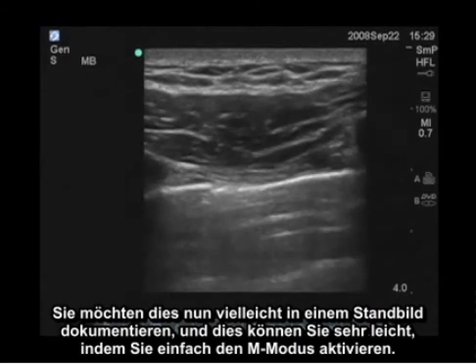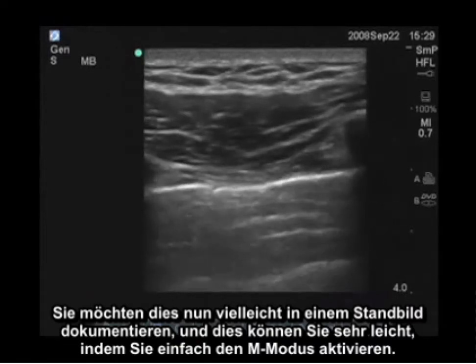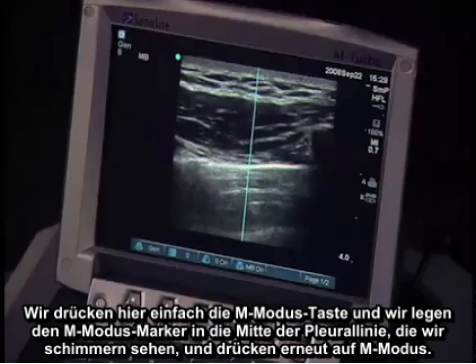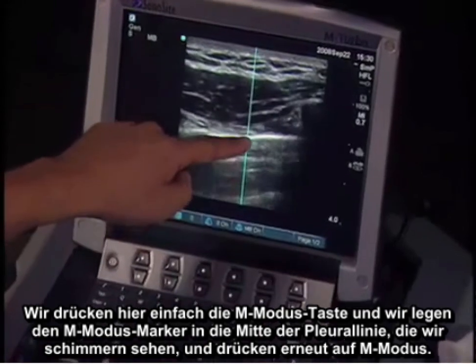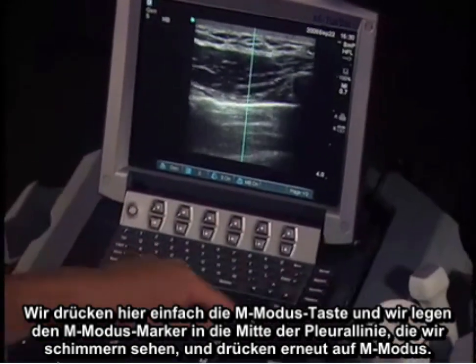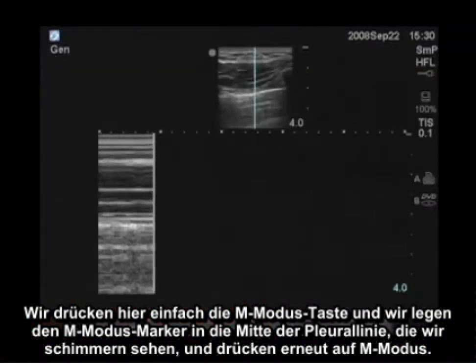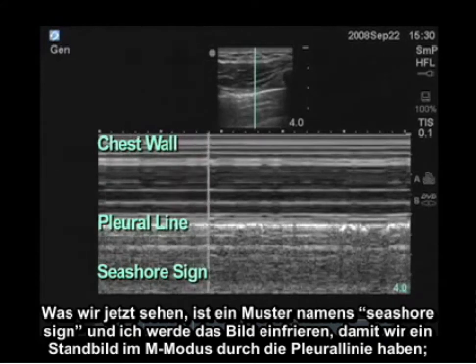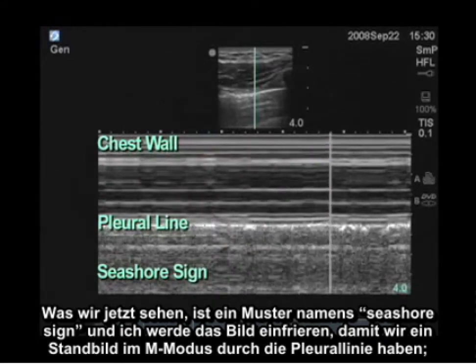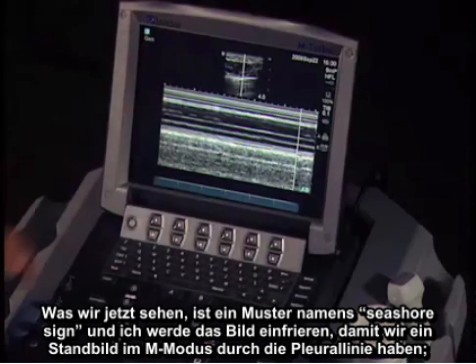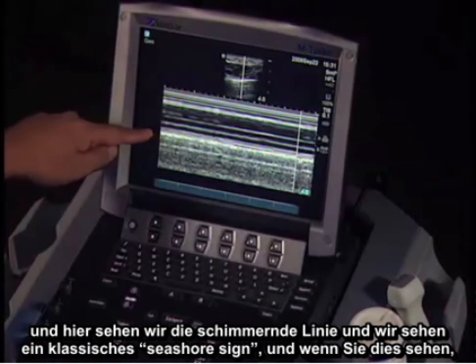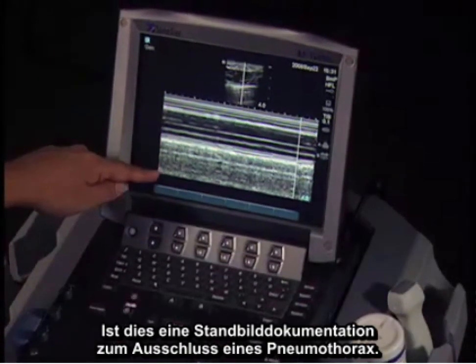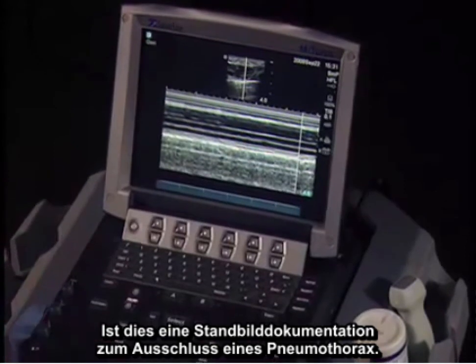You may want to document this in a still pattern, which is very easy to do by activating M-mode. We hit the M-mode key, put the M-mode marker through the center of the pleural line where we see shimmering, and hit M-mode again. What we see now is a pattern called the seashore sign. I'm going to freeze this — so now we have a frozen image of the M-mode through the pleural line showing the classic seashore sign, which is still documentation of exclusion of a pneumothorax.